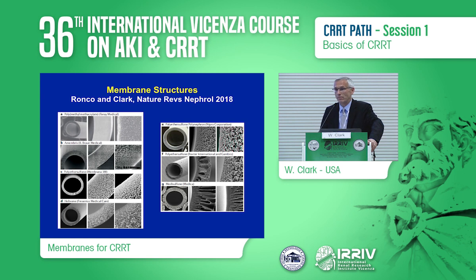That didn't used to be the case necessarily because of the conditions that were used, and I'll talk briefly about that. For the most part, though, we're leveraging what goes on in terms of chronic filter and membrane production. There are a whole host of different membrane structures. Of course, we're using high permeability synthetic membranes for CRRT.